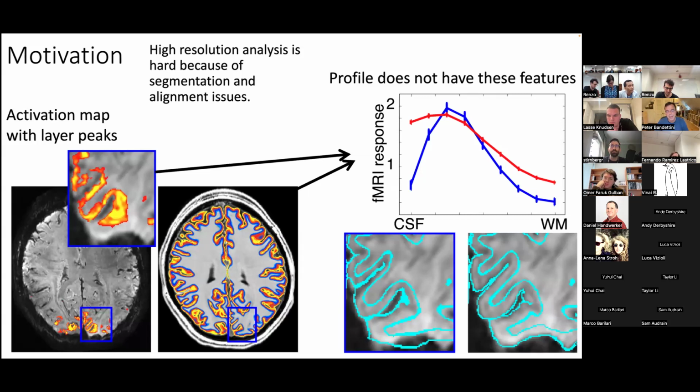Obviously there are many things that cause distortion, and you mentioned phase errors, but the way I think of it, and the audience will all be sophisticated, it's nice to simply say that readout window length is the big factor that causes distortion. With typical acquisitions, the readout window length is really short, while echo planar is really long. It's not perfectly correct, but it gets the point across.